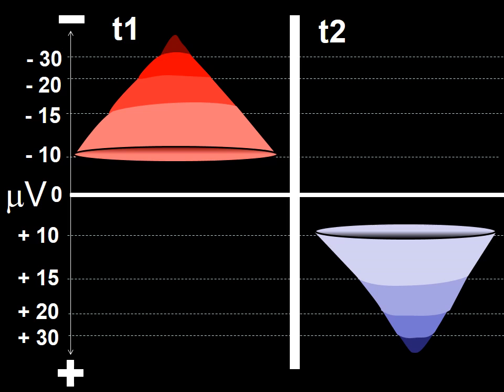In any of the previously described situations, all the potentials will either be more than the minimum or less than the maxima, and all the waves created by these potentials will be expressed in the same direction, or they will be neutral.